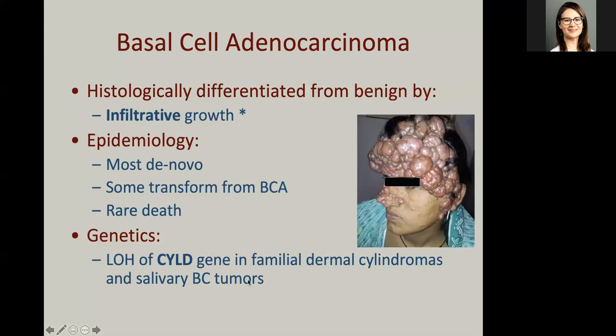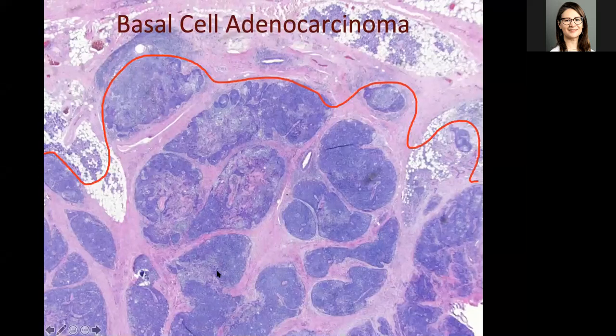So same gene implicated in these tumors is also present in the salivary basal cell neoplasms as well. What you see is these similar large blue nests, sometimes with an almost jigsaw puzzle rearrangement where the nests are kind of matching each other up, right? You can see here, there's actually a nice example of the contours being matched like a jigsaw puzzle.